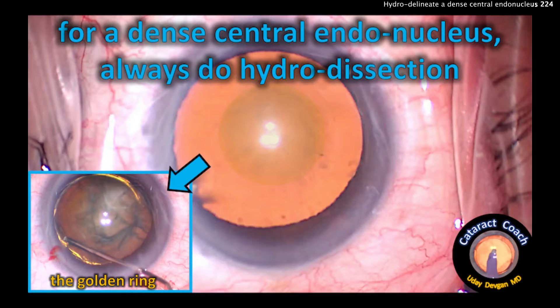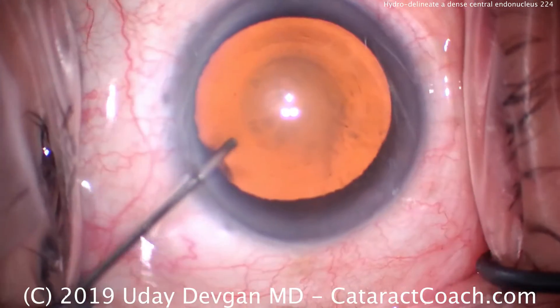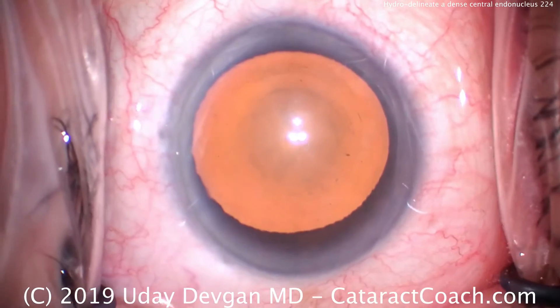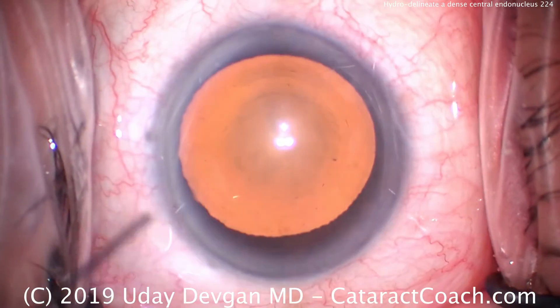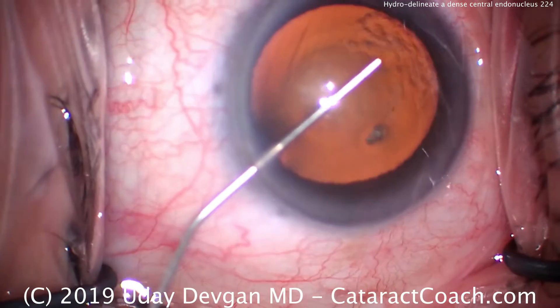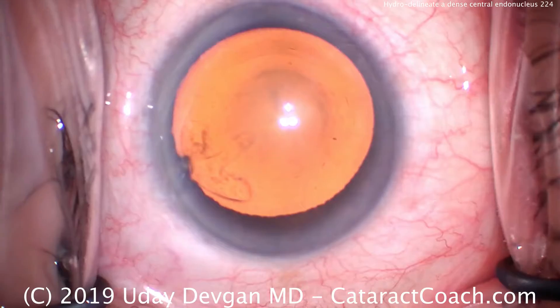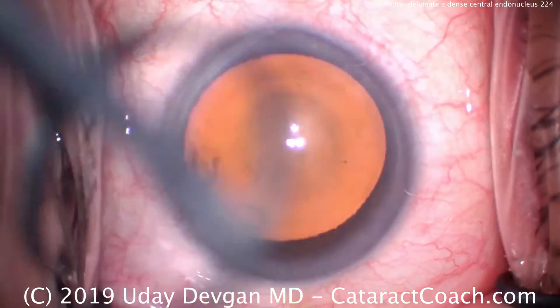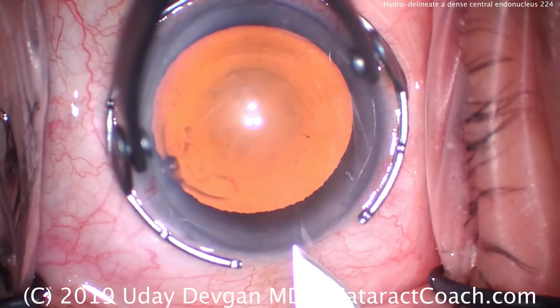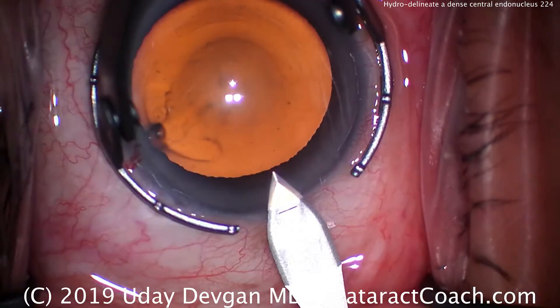If you have a dense central endonucleus, you should always do hydrodelineation. Look at this eye — in the center you can see the delineation of the dense part of the nucleus. This patient has dense central nuclear sclerotic changes, which have caused a myopic shift and, of course, poor vision. That central part of the nucleus is very dense, whereas the periphery of the nucleus is a lot softer.